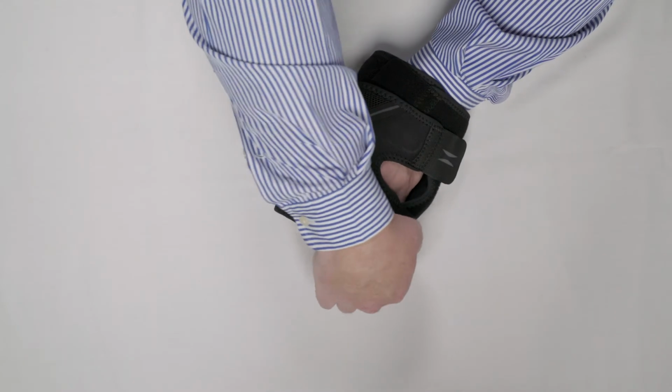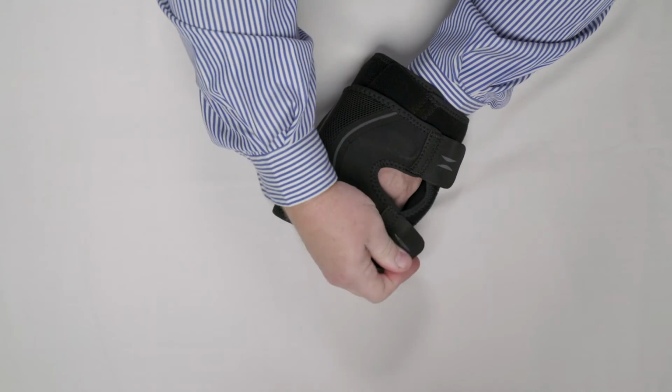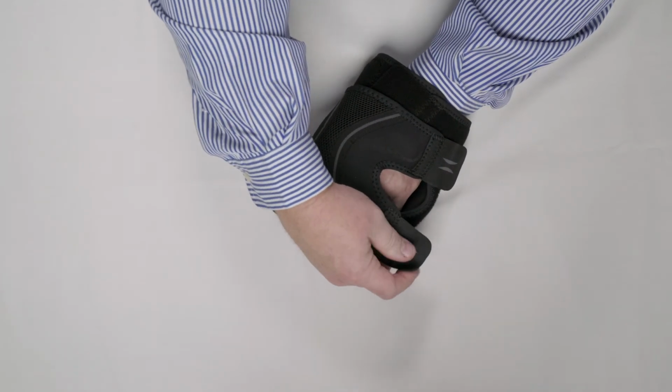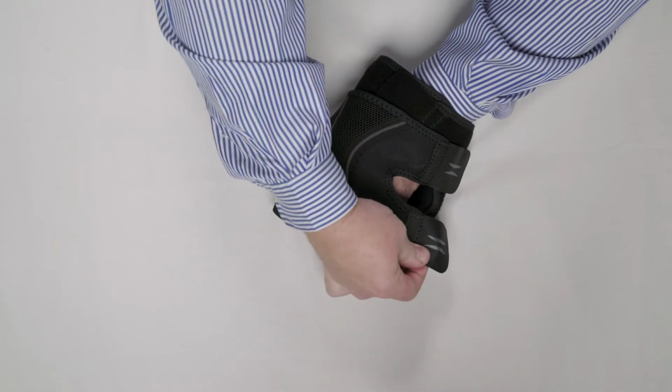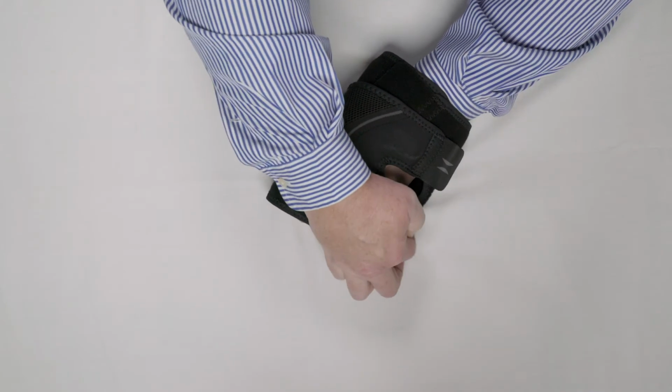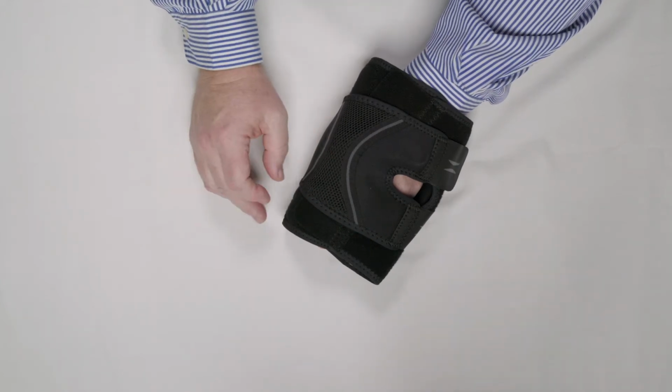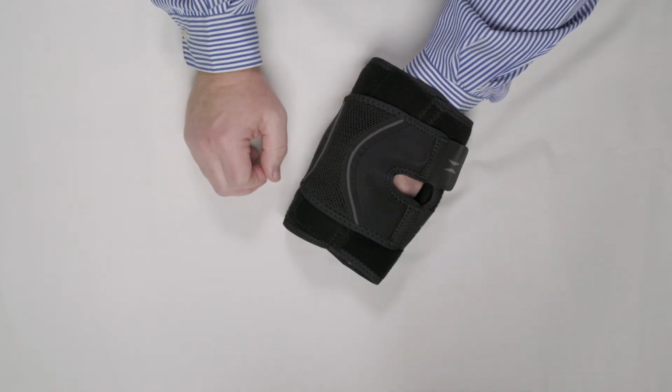That's why the brace is superior to taping, in that an incorrect force on tape cannot be corrected without removal and reapplication. But with the Shields brace, fine-tuning, a little more tautness or a little less tautness in the straps, allows us to find that most pain-free position of the patella.